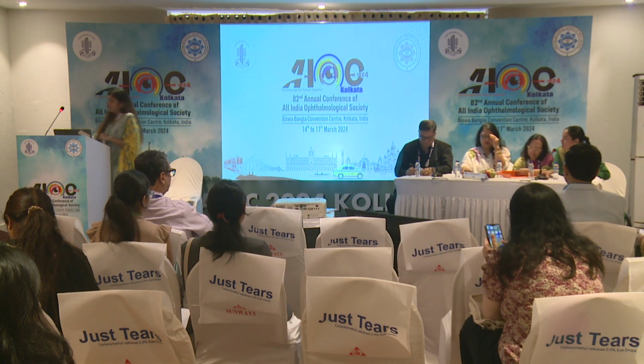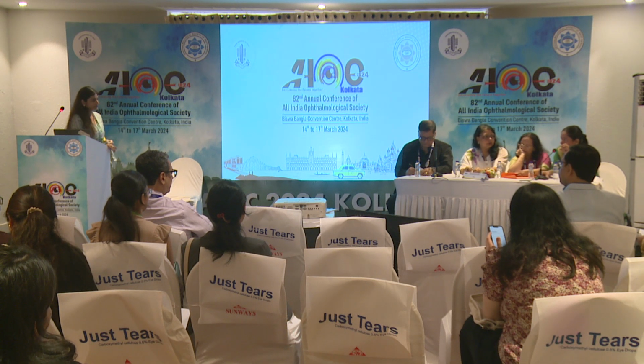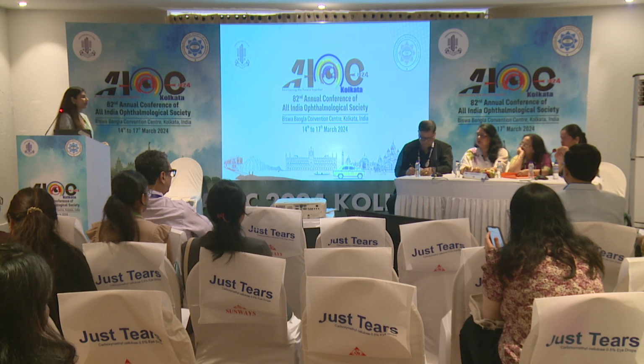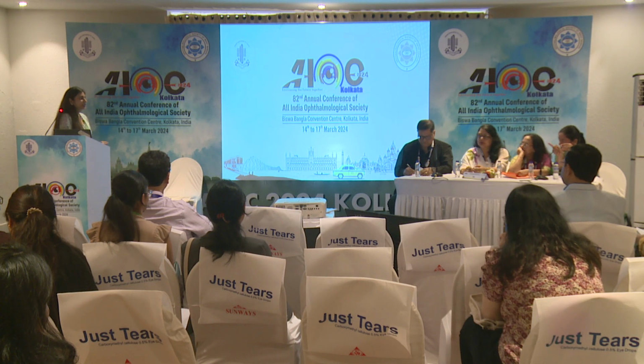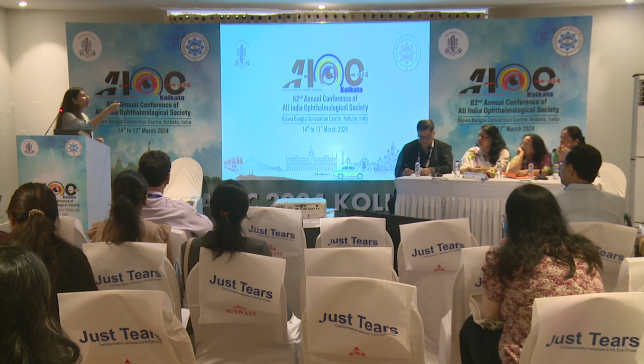Since it has a small fulcrum, if the intraoperative miosis is more, suppose the pupil is fully dilated, fine, it will hold a little bit of iris. If the intraoperative miosis is more, it means more of the iris needs to be pushed back. Will it work? Yes, the dialer tip is 0.9 millimeters, so it works even in very small pupils. It's longer than the usual dialers.